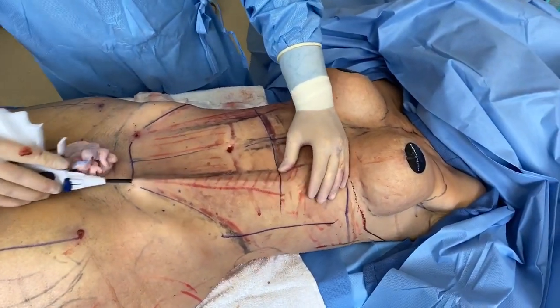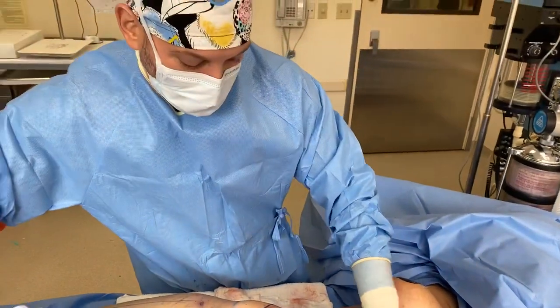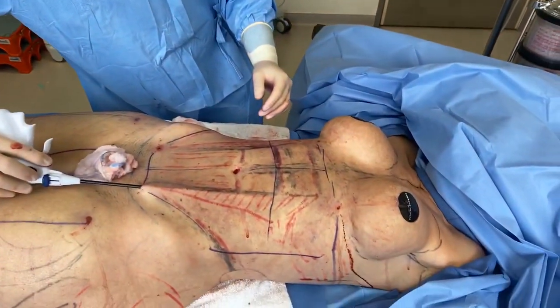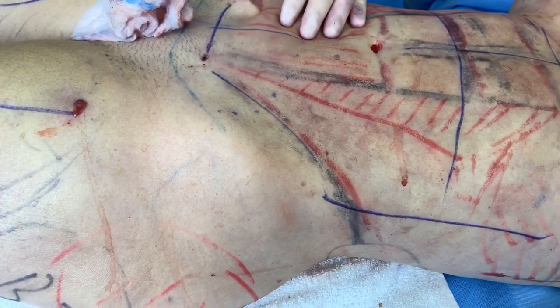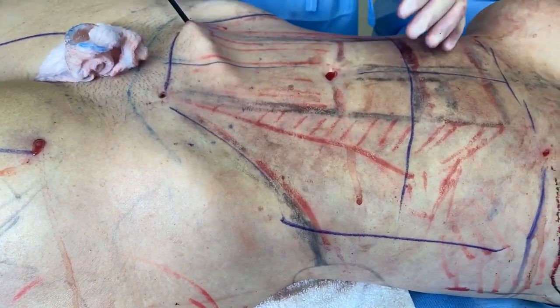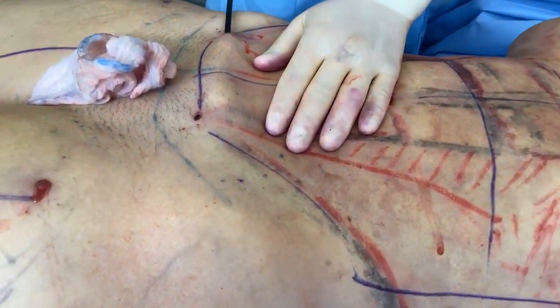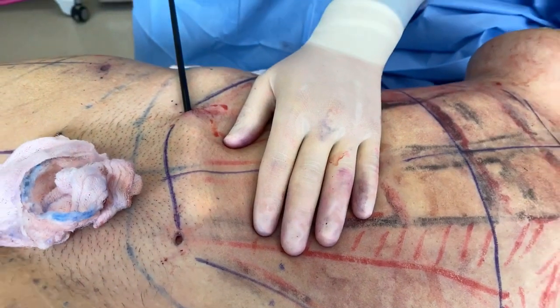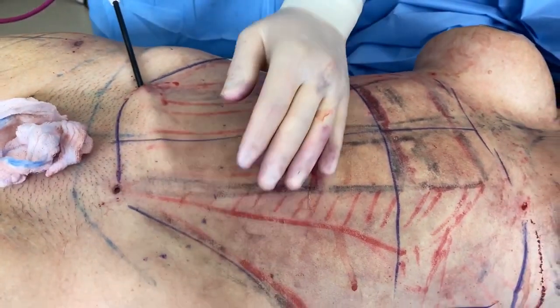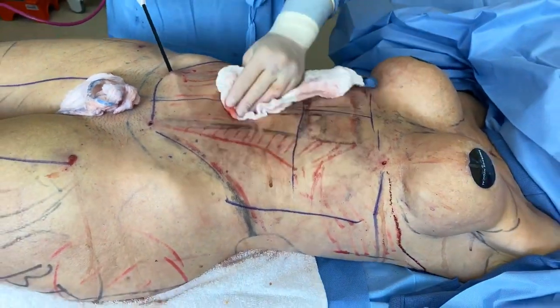Once we get improvement, you maintain that with body treatments, hormone therapy, good nutrition, and training. You can see the smoke literally coming out — let's see if I can show you guys — we're going to do a few more passes here.